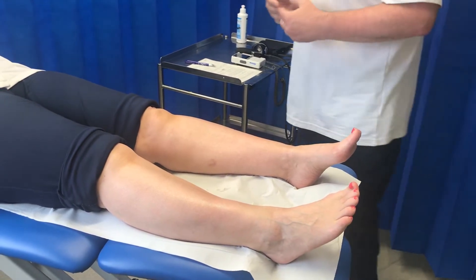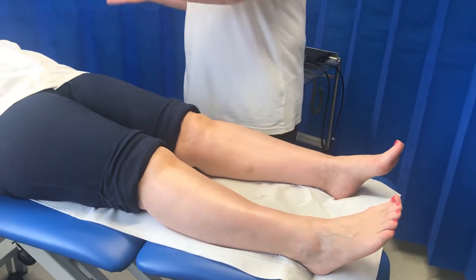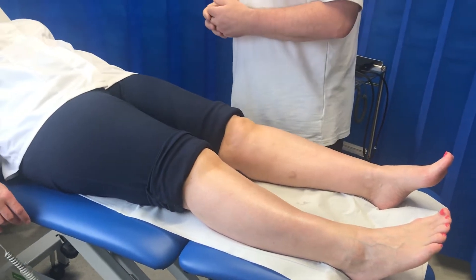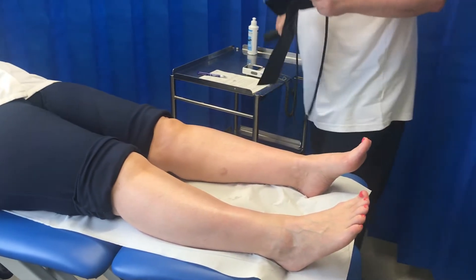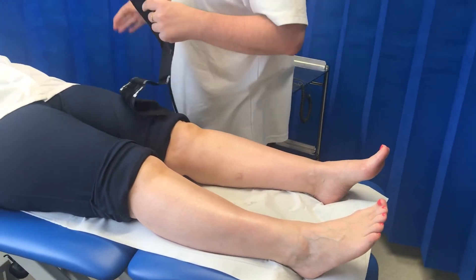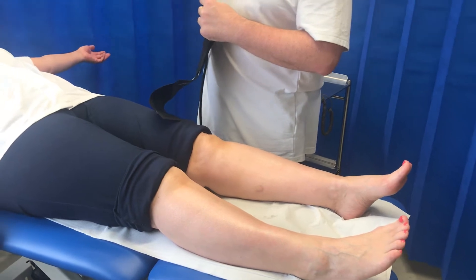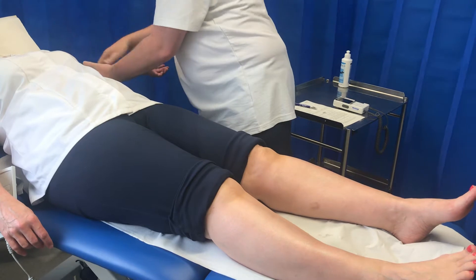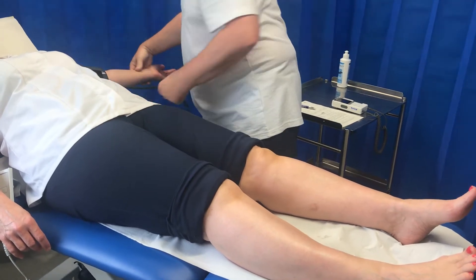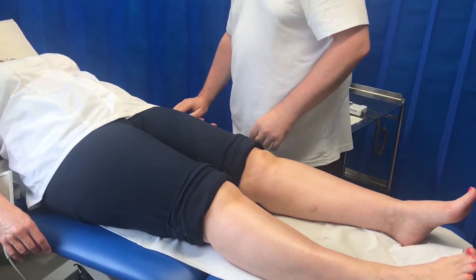First of all, I'll explain to the patient that I'm going to be doing blood pressures on their arms and legs, and take consent. I'll get my cuff and come to the arm first of all. I'll ask the patient to put their arm out to the side by showing them, and then I'll put the cuff around the upper arm, above the elbow, about two centimetres above. I'll ask the patient to bring their arm in and just rest it gently.